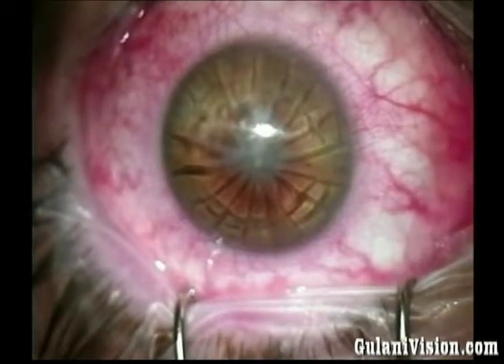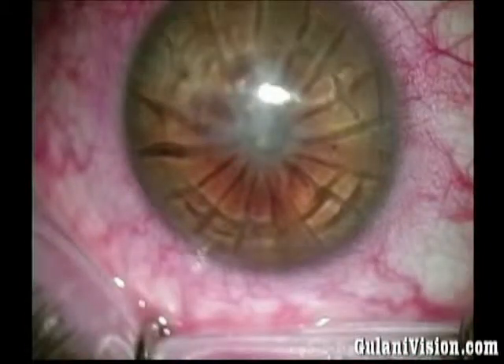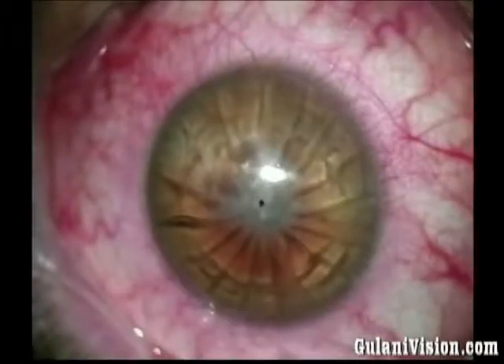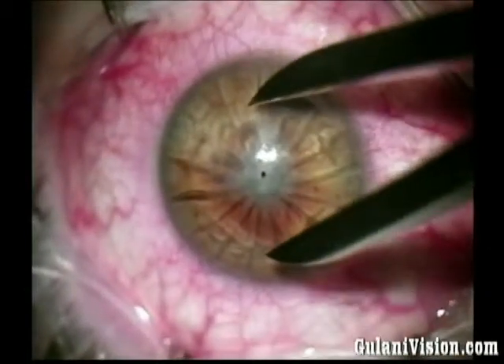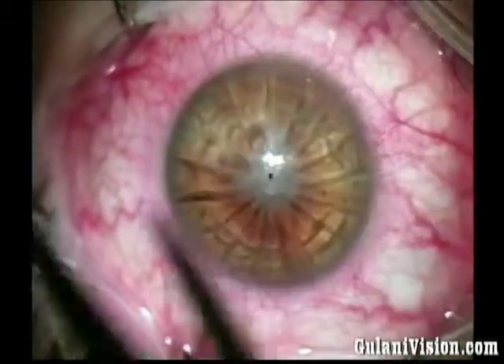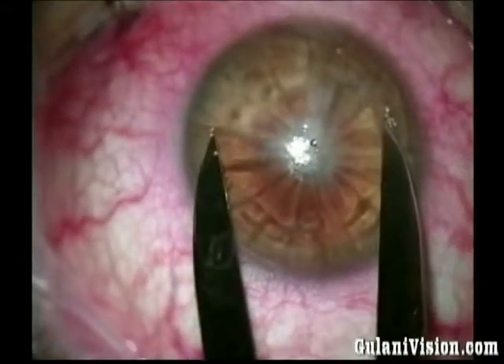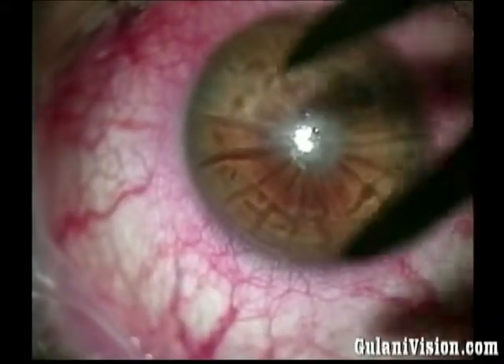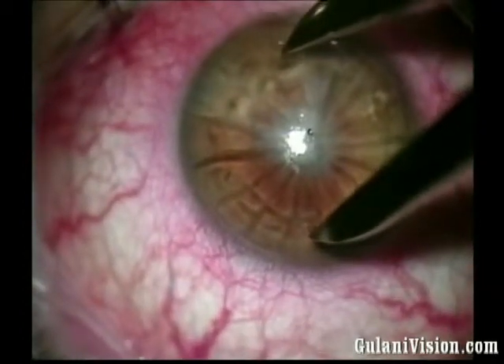This is a case of an 18-incision RK with a dense central scar, ectasia, and thinning. Using corneoplastic principles, I would like to remove the scar and add tissue using a lamellar technique to build this for future laser ablation. There are also four arcuate astigmatic incisions in a circular pattern intersecting these deep RKs, so I want to be just outside that circle but still not too far out.